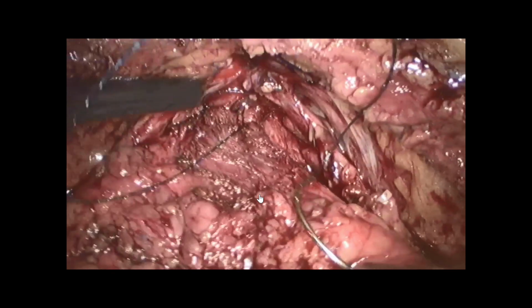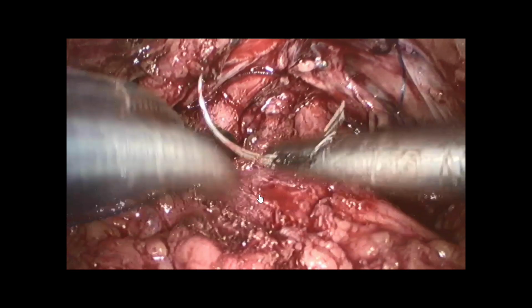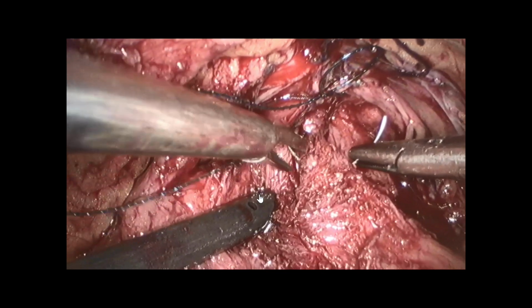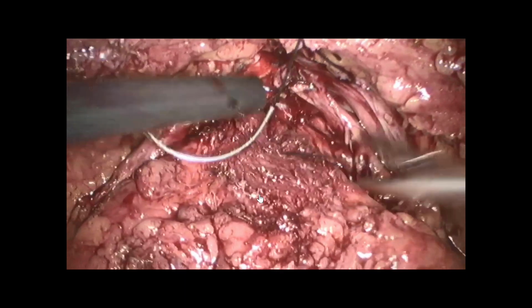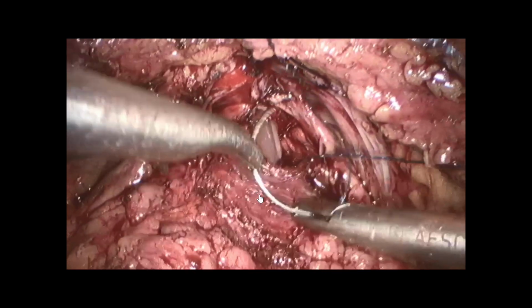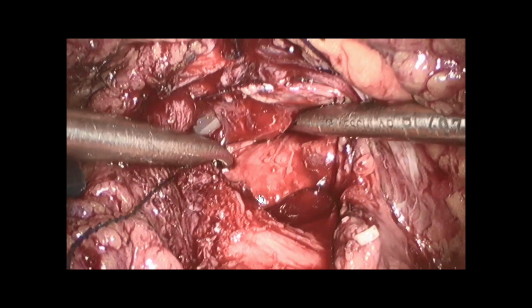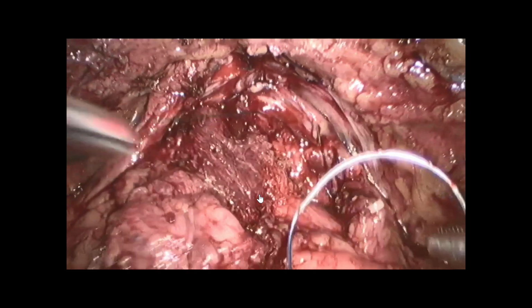And then, at that time, I was placing the Benique metallic guide, but you can do it exactly with a Foley catheter. The only problem with the Foley catheter is sometimes that you can pick the Foley catheter and you can be inside. With the metallic guide, it was not possible. And you see now the catheter, and you see here, I pay attention to the outside of my needle to be not too large, and then I will finish.